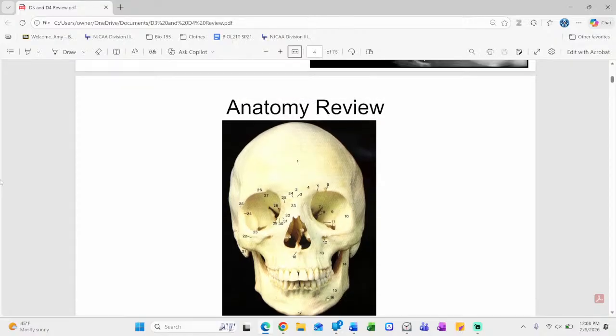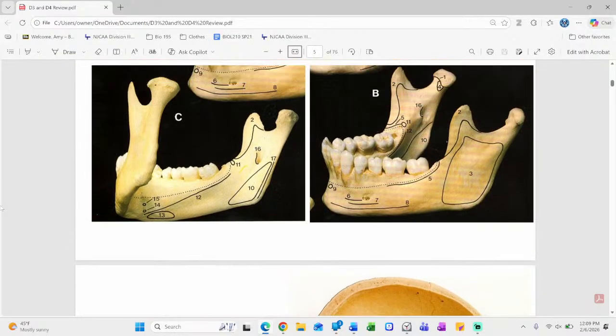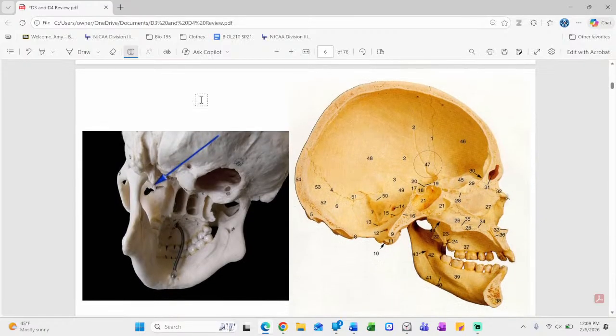Any questions? I don't need to go through anything here unless somebody's got some questions. And if, after I finish, the D3s want me to come back to anatomy a little bit, I will. All right, but if anybody has any questions now, otherwise, that's the frontal view of the skull, and then of course here's the dry mandible. So of course we've been over all of these muscle attachments here. Everybody good on all those muscle attachments? And again, it's just knowing when you look at a panoramic what all is sitting there that is invisible. You can't see all those muscles. Dry skull from the backside.